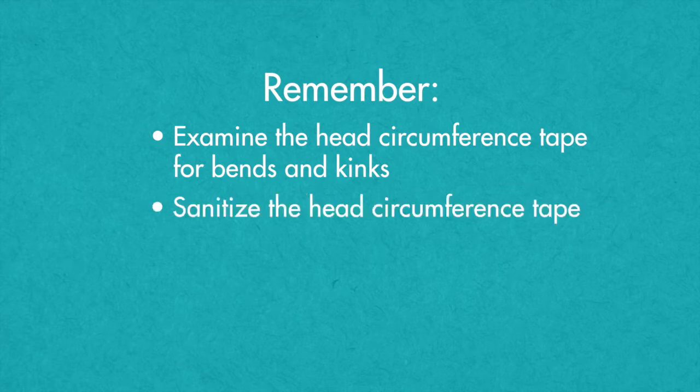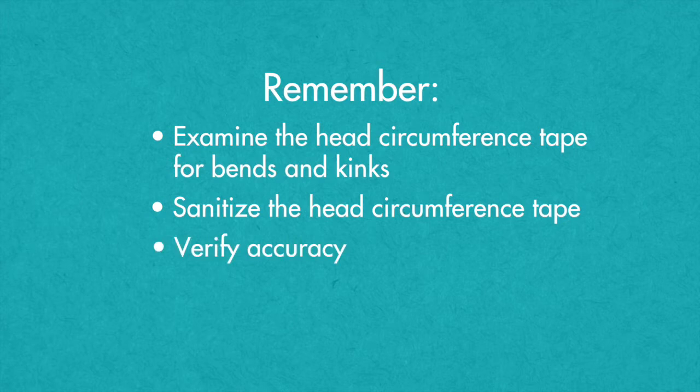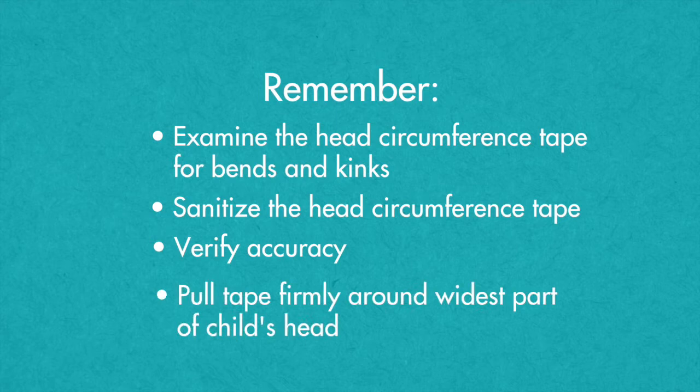A bent head circumference tape will not provide accurate results and should be replaced. Sanitize the head circumference tape before use, between children, and after use. You can always repeat the procedure to verify accuracy, especially if the child was moving. The tape should be pulled firmly tight around the widest part of the child's head.